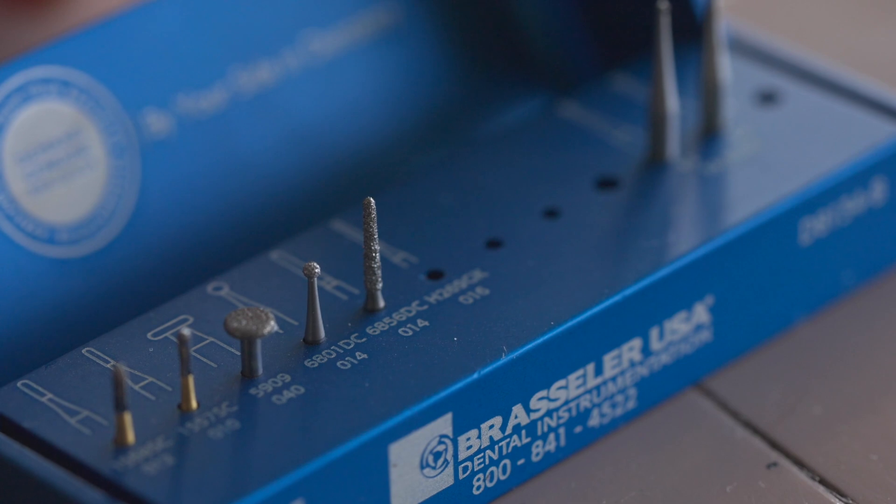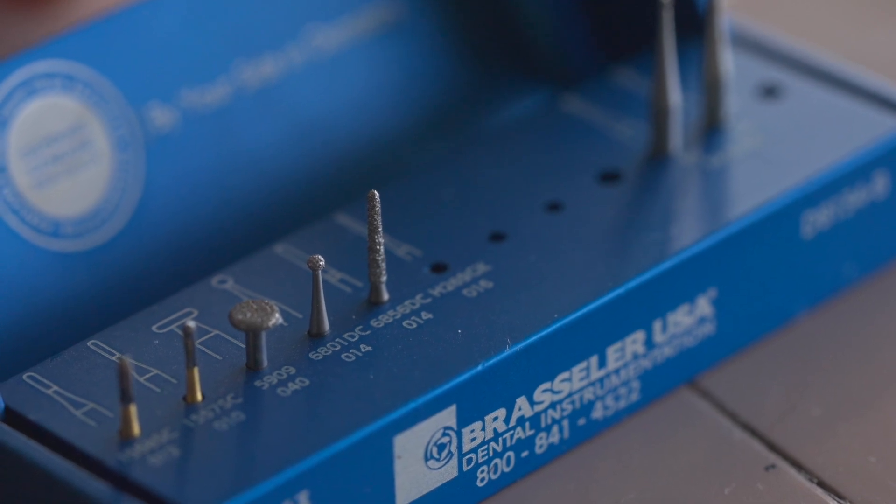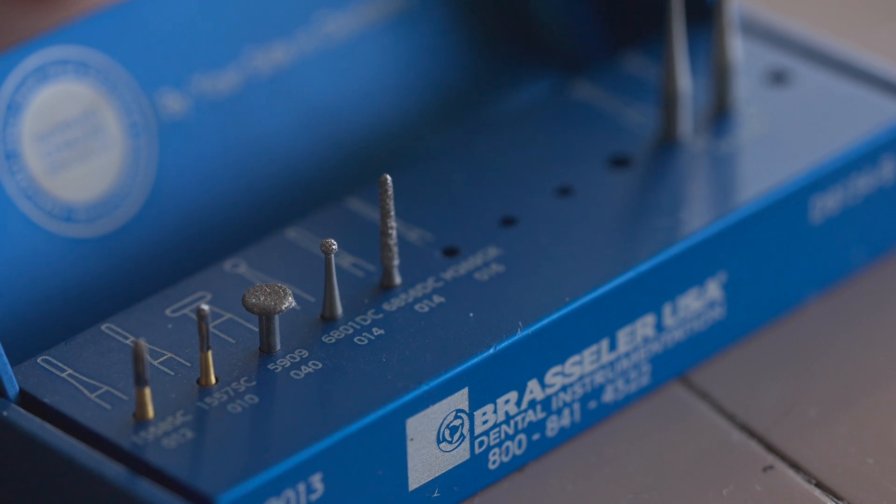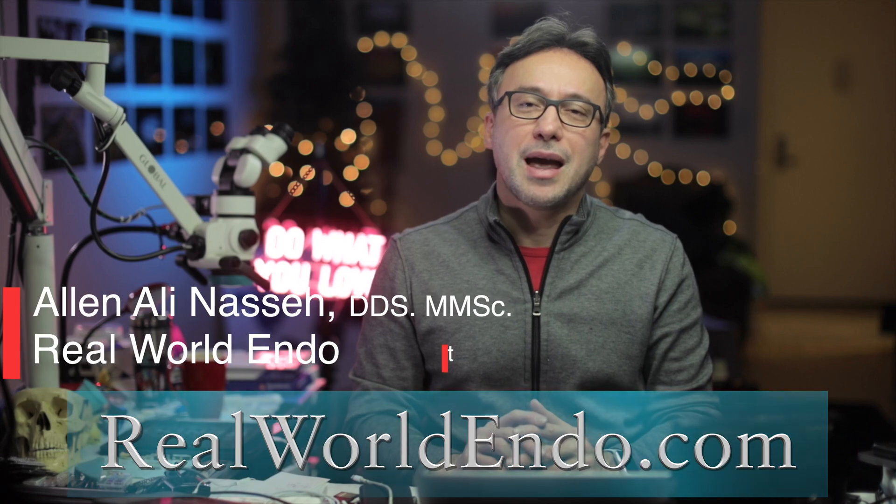I'm very proud of this minimalistic kit that packs a punch and helps you access through modern materials using burrs of the highest quality, allowing maximum efficiency. I'm sure you will find this collection of burrs extremely helpful during your access preparations. If you have any questions, visit me on social media or our website, rewildendo.com, and drop a message.